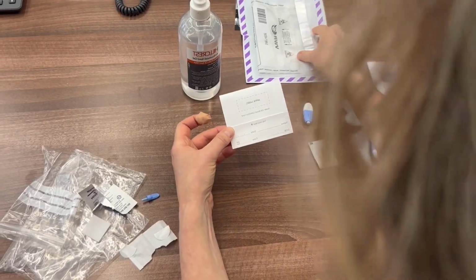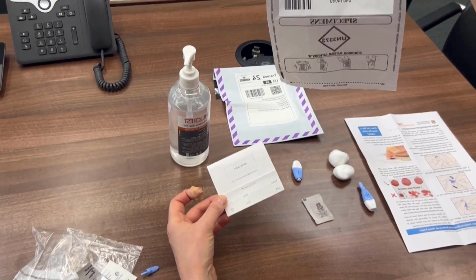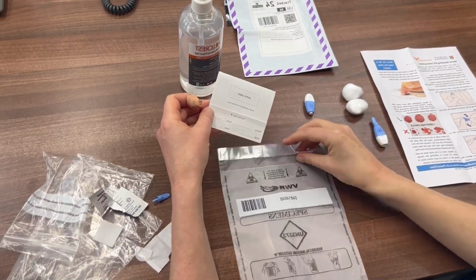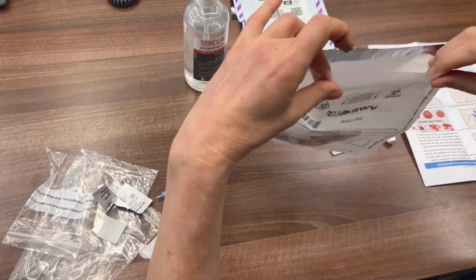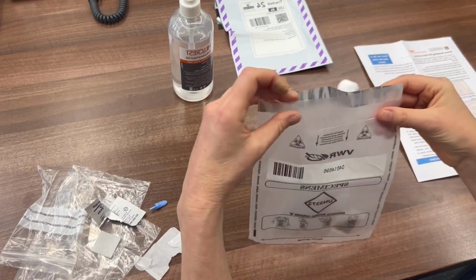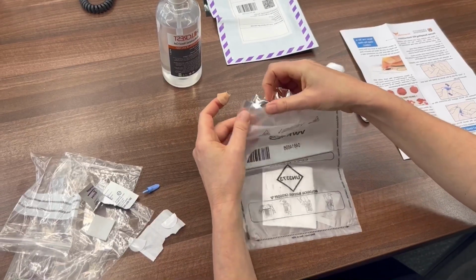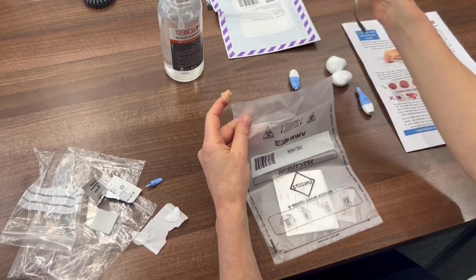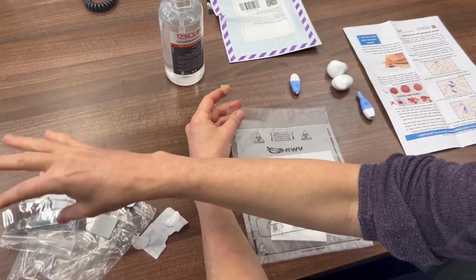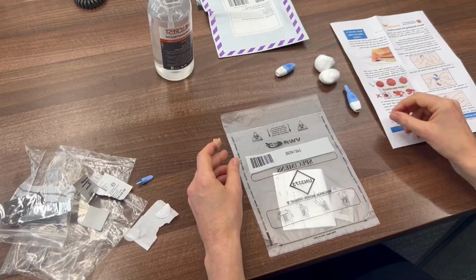What we then do is go to our specimen bag, and that says UN 3373. I then put that safely in there with the little desiccant bag. Now, it is a sealed bag, so it should remain nice and dry, but that desiccant just makes sure that is the case. You remove the sealant and put that aside. And then if you just rub across the top, your specimen is now really safe.